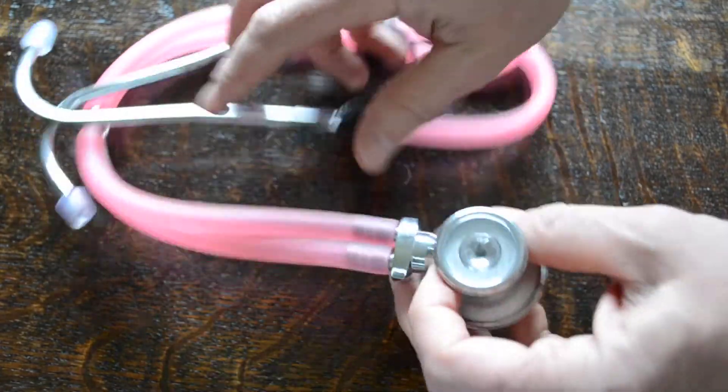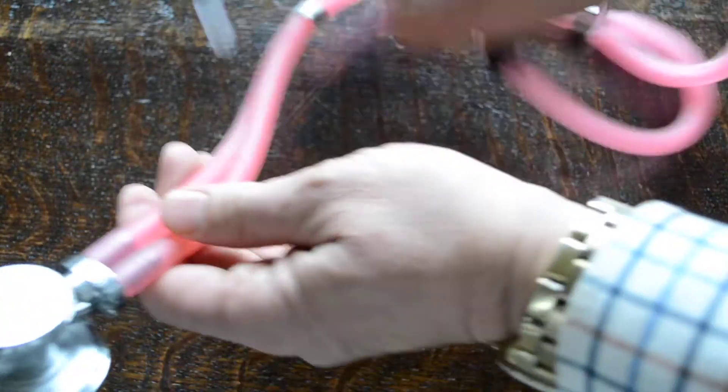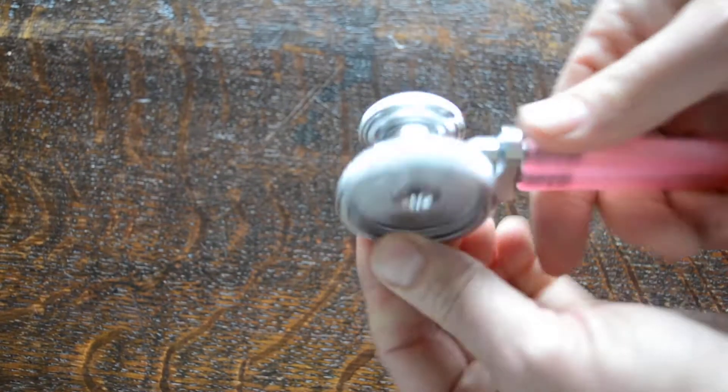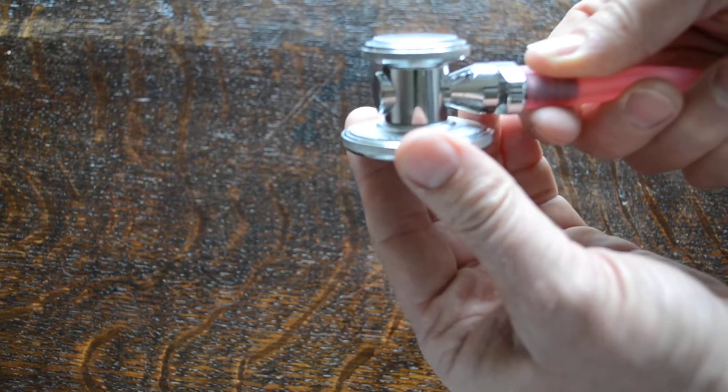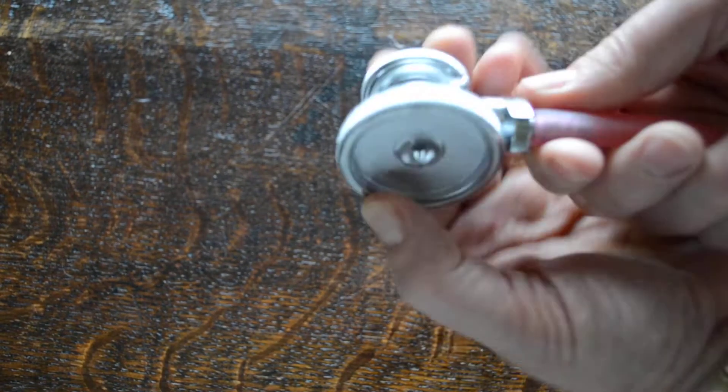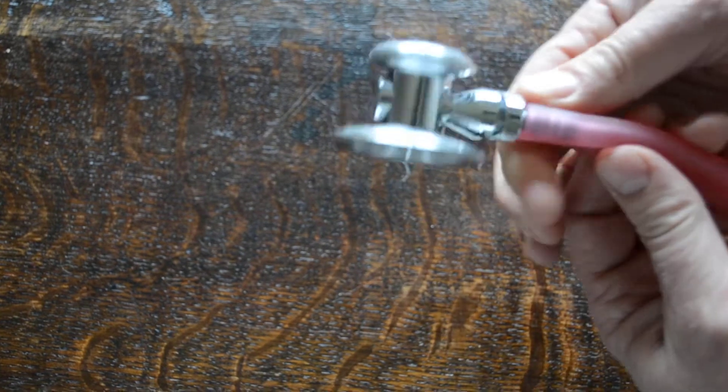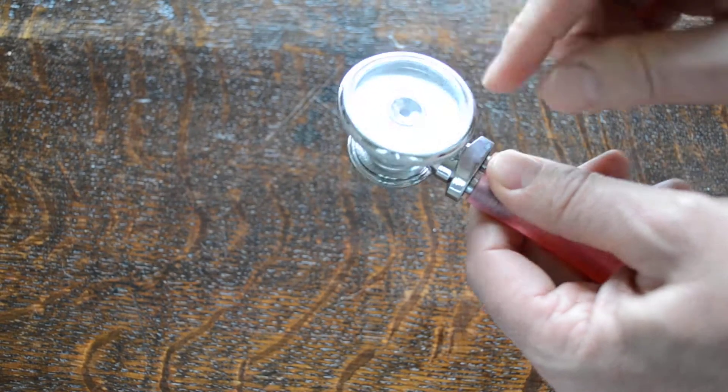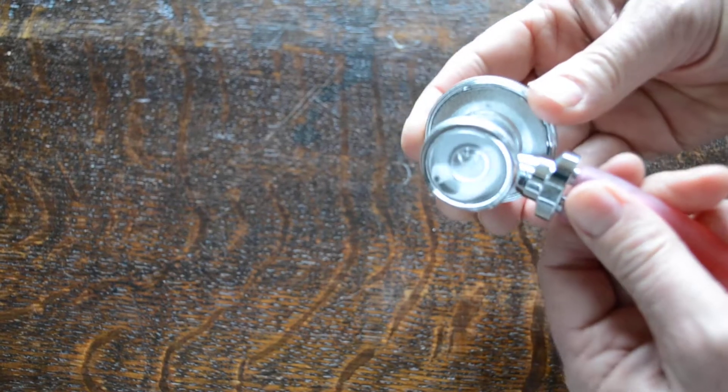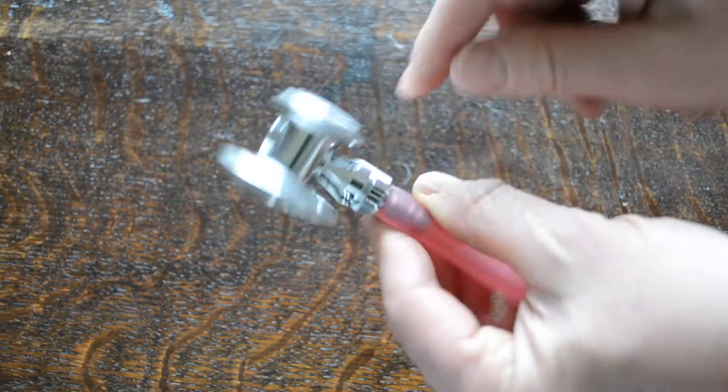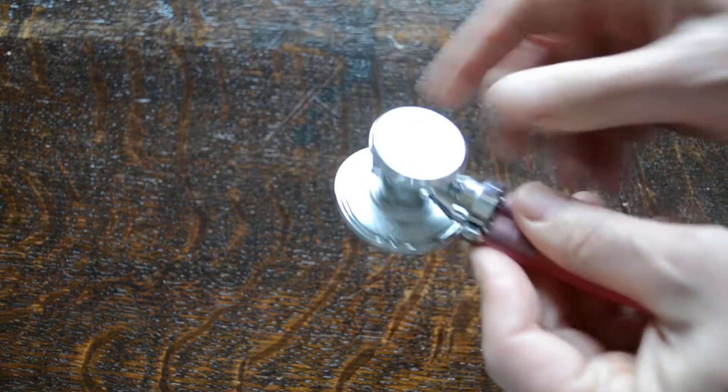It's not a skimpy short tubing, dual lumen tubing. The chest piece on this is surgical steel, nice heavy unit, good rotational lock. It's easy to select the position of choice. Clear diaphragms on this unit as it comes set up in the box with both a pediatric and an adult diaphragm chest piece on there.